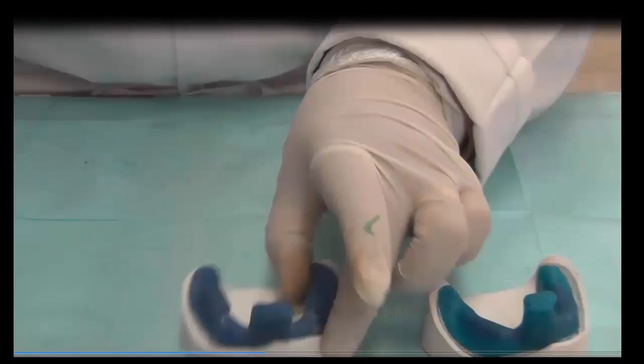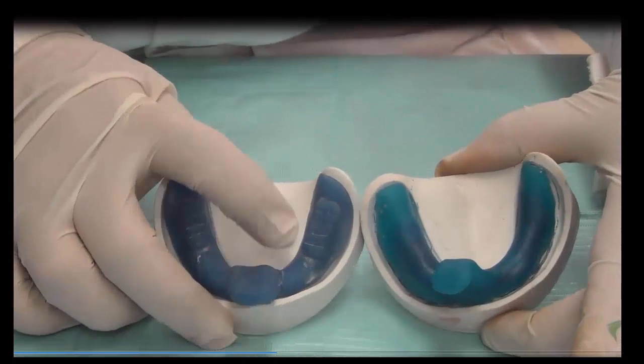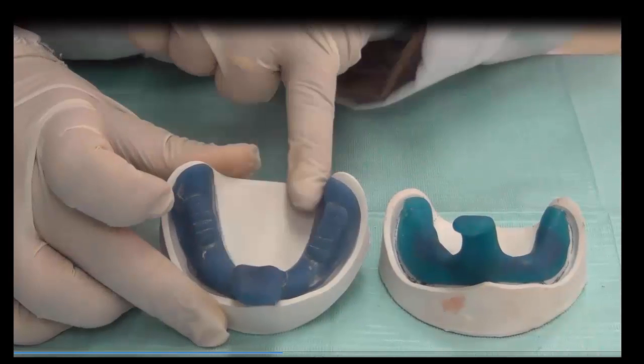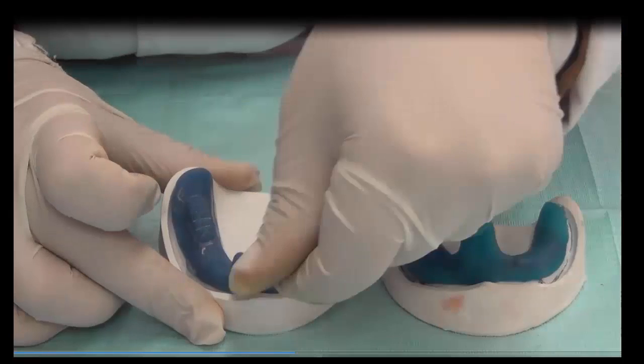For the lower, the same features. So we have the lingual area free. The tray does not extend to the lingual area because we have the tongue here. It only extends on the ridge, so it has this U-shape. The body has the U-shape, the handle.